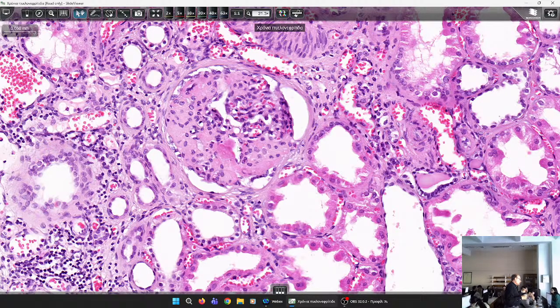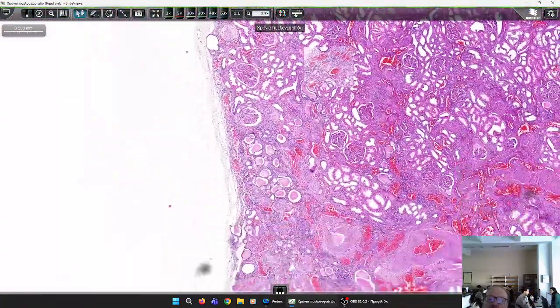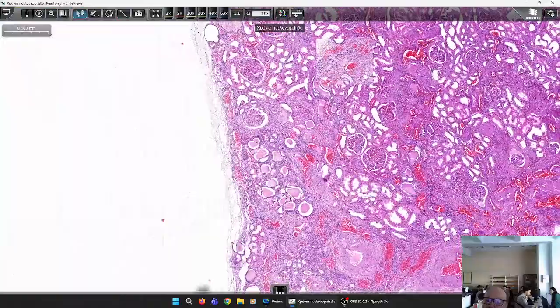They were thickened. The glomeruli did not receive enough blood supply, so they were fibrosed, and this caused the atrophy of the tubules. This is the mutual dependence of all parts of the renal parenchyma. So we saw all that damage here due to chronic pyelonephritis. Here are other atrophic tubules with flattening of the glandular epithelium lining them.